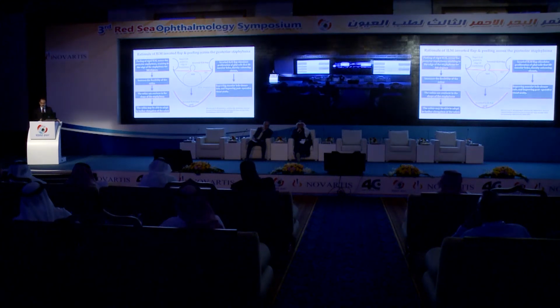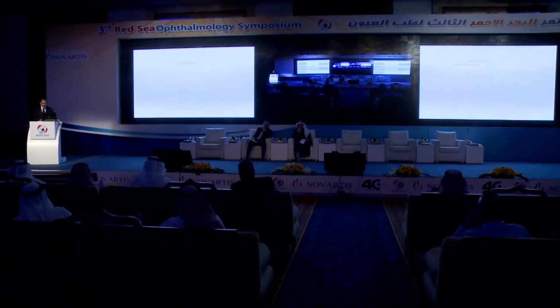So we changed the technique completely into the inverted flap. So in addition to relieving the traction induced by the rigid internal limiting membrane, the ILM flap stimulates proliferation of glial cells because by default, the internal limiting membrane is a basement membrane, and the glial tissue was used to fill the macular hole.